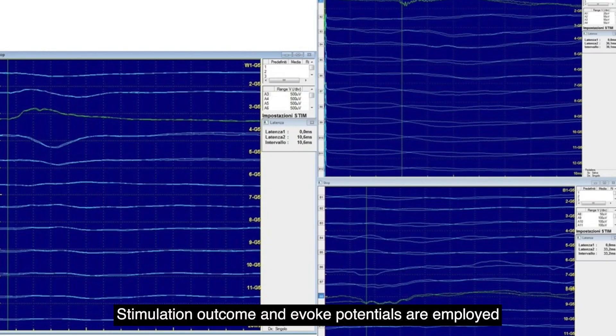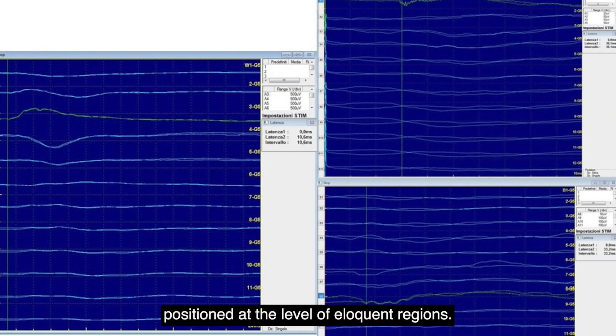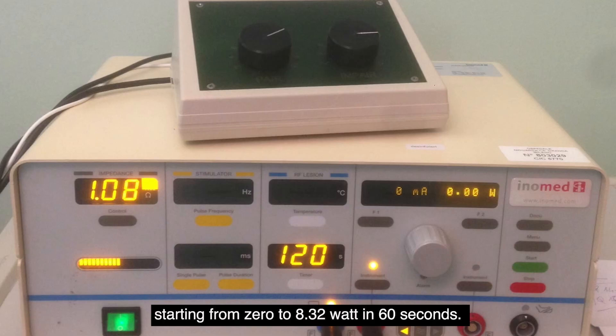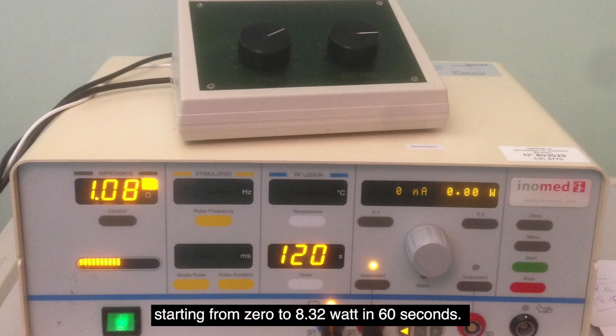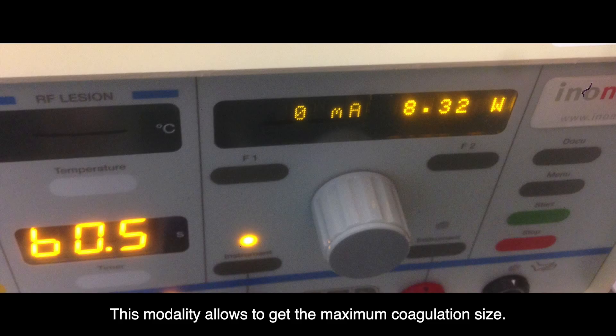Stimulation outcomes and evoked potentials are employed to avoid coagulating through electrode positions at the level of eloquent regions. Coagulations are performed at bedside in a bipolar manner, starting from 0 to 8.32 Watts in 60 seconds. This modality allows achieving the maximum coagulation size.